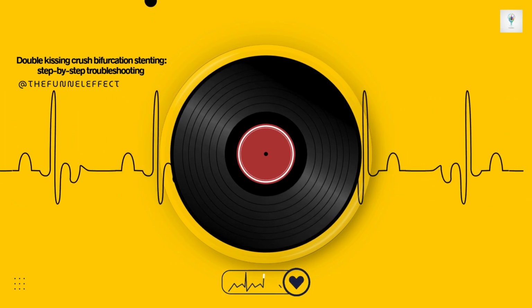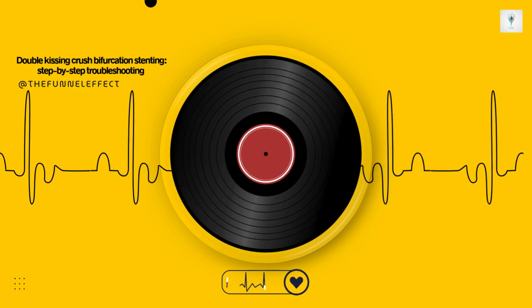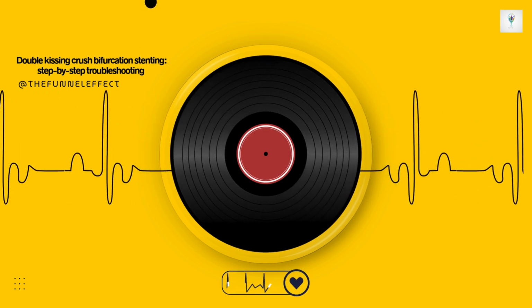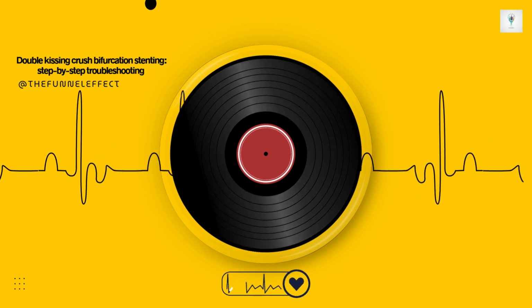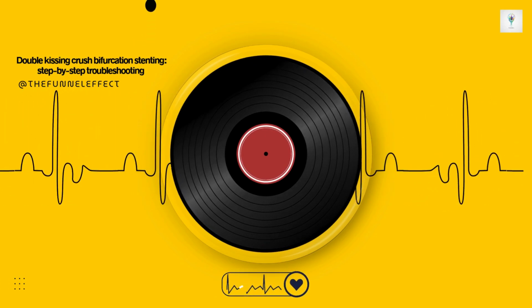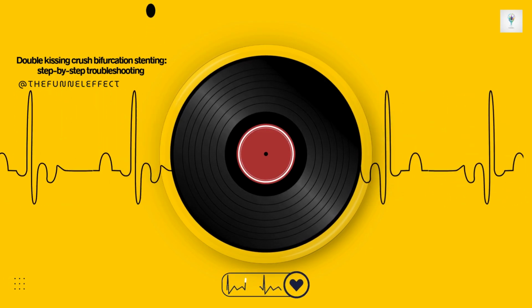Yes, this can often be the toughest rewiring challenge. The wire now needs to navigate through the original crushed SB stent layer and the overlying MV stent layer. The strategy is the same as step 5, following that troubleshooting algorithm, figure 3. You'll likely need those polymer-jacketed wires again. Maybe the hairpin technique if the angle is severe, and microcatheters, especially dual-lumen ones, can be lifesavers here for directional control.